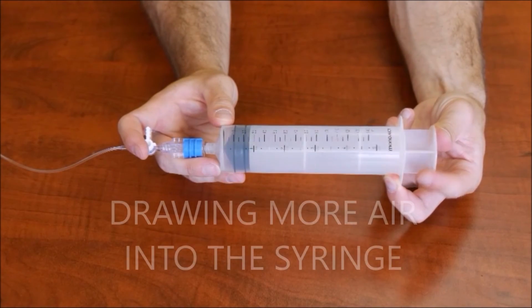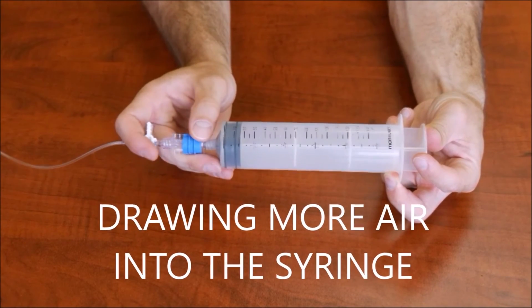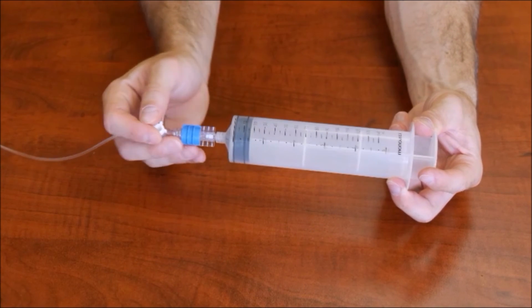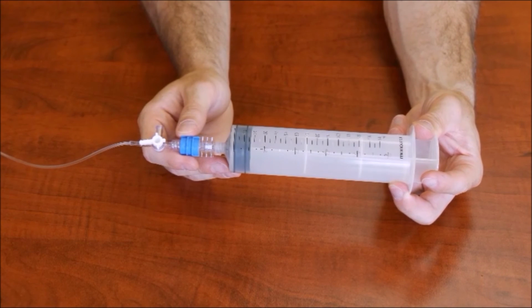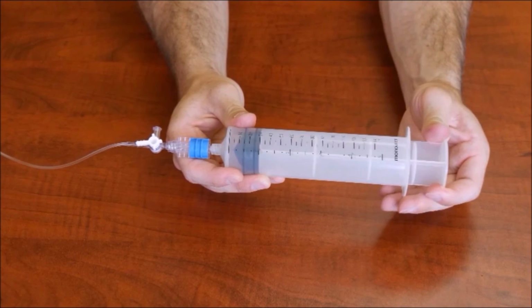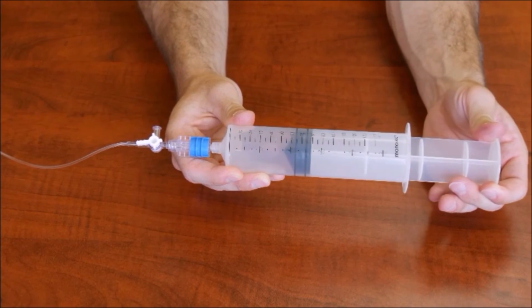If you reach a point where you need to draw more air into the syringe, flip the flow control switch to off, and then follow the earlier steps of making sure the luer lock is in the off position and the flow control switch is in the on position. Then draw back to the desired level, remembering that the maximum for the rectal balloon is 180 cc's of air.